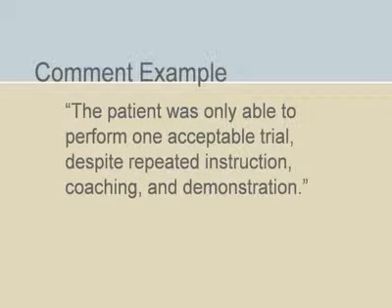A comment of failed test performance may look something like this. The patient was only able to perform 1 acceptable trial, despite repeated instruction, coaching, and demonstration. In this case, the data obtained from the 1 acceptable trial referenced should be included.